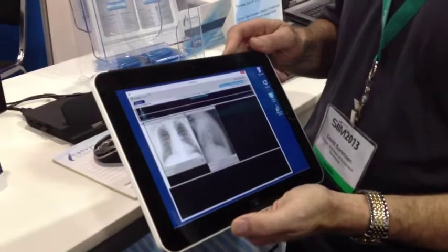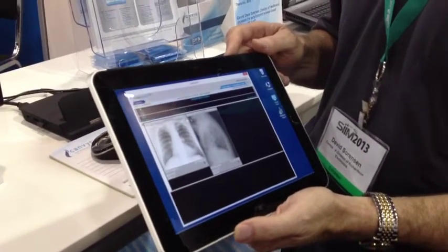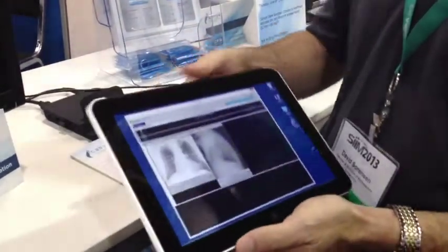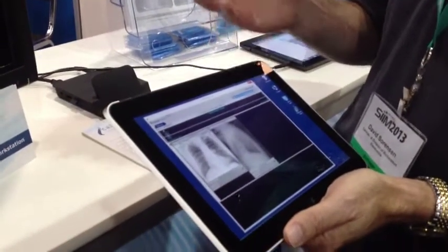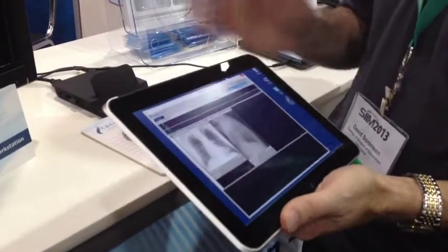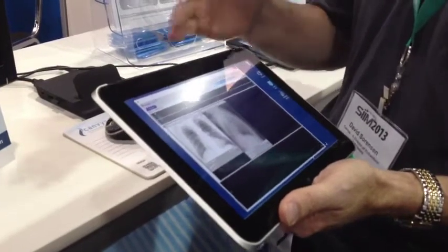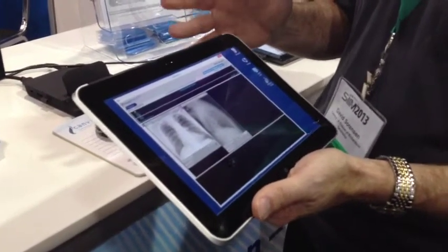Here's an interesting use case involving a tablet and a diagnostic display monitor. What we have here is an HP ElitePad 900 tablet with a medical imaging viewer. I could pull up an image and take a look at it, but like a chest image, you don't really want to be looking at that on this tablet — it's not ideal.